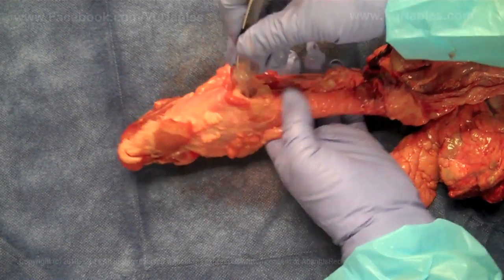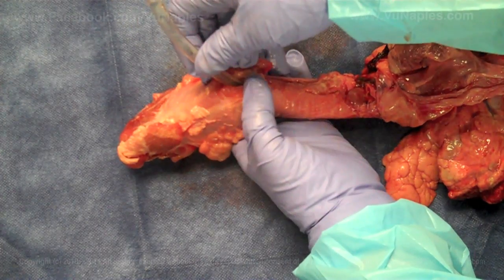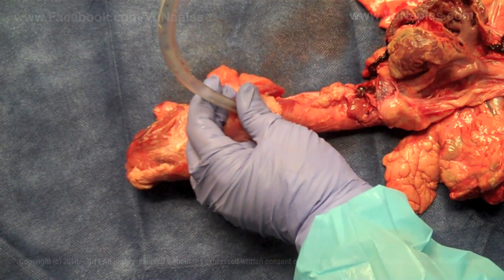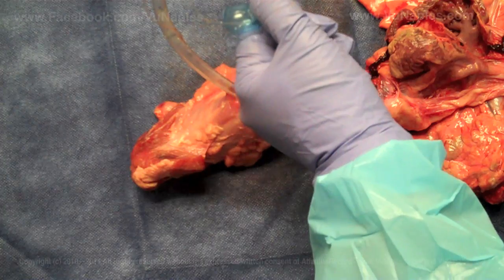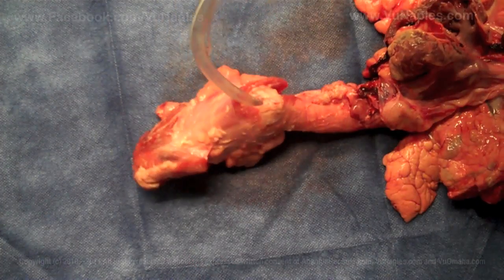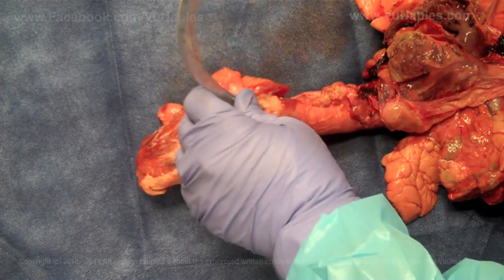Normally, the patient will be in a head tilt position, and you're just going to push the tube past that black line. Once you've passed your tube past the black line, you're going to inflate your cuff, and you're going to listen to the lung sounds. And this is how you perform a surgical cricothyroidotomy.